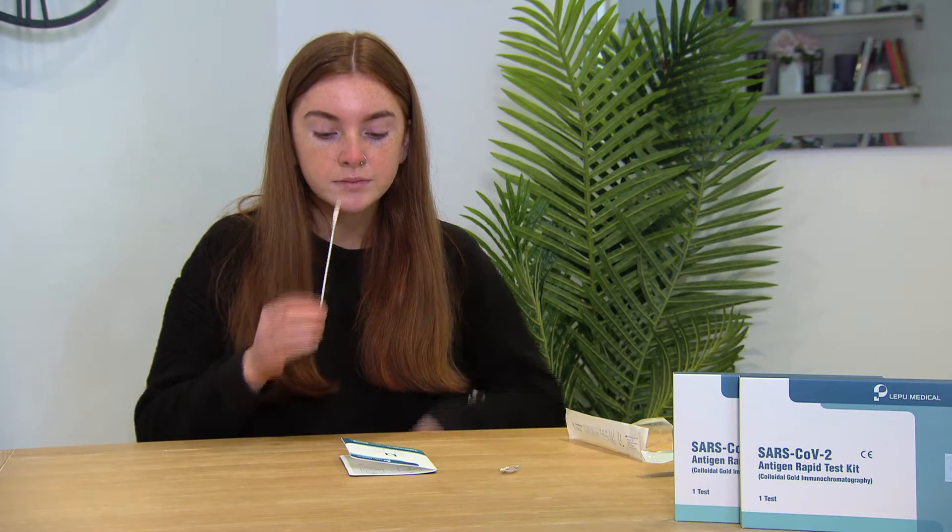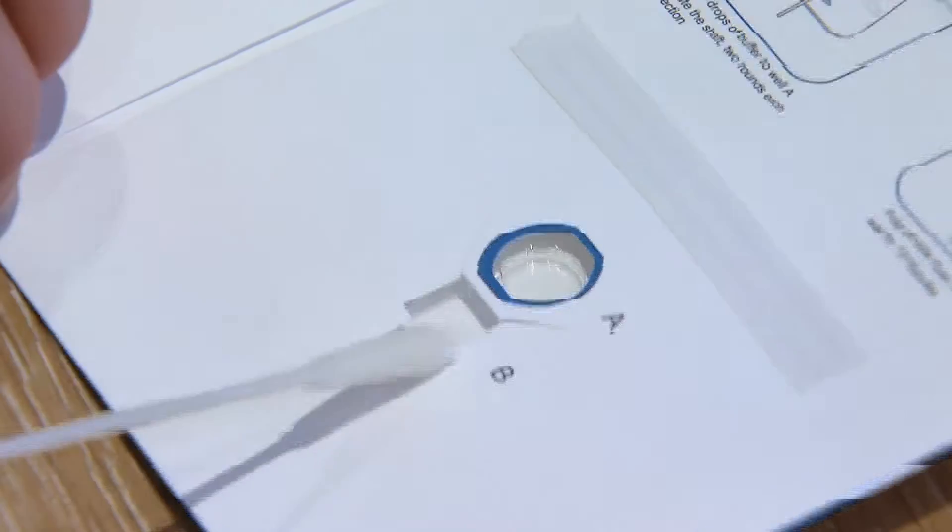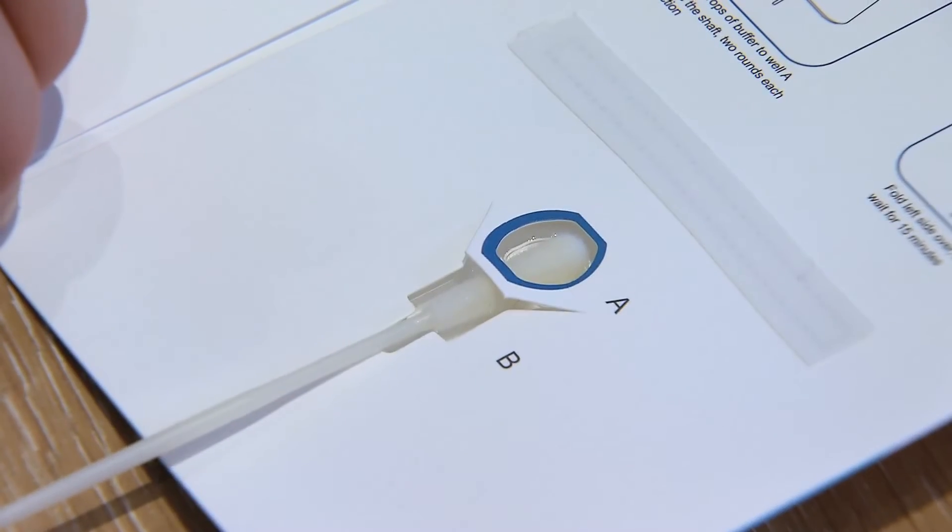Step 3. Insert swab into opening B on the test cart and push upwards until inside cavity well A.